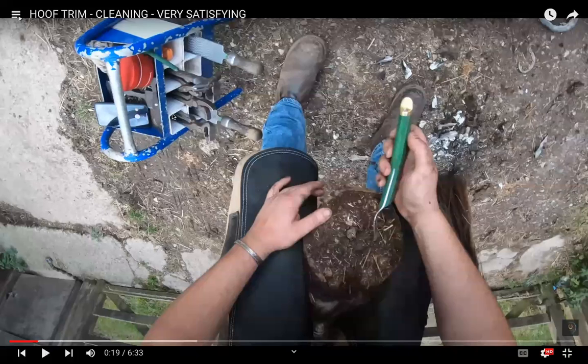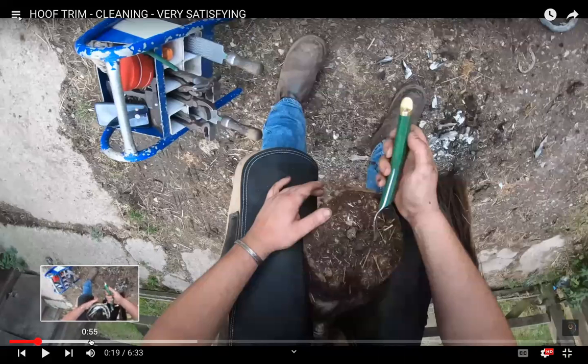So this is the little equipment stand that they have over here. You can see their hoof wraps. This is going to be a hoof pick. So they're going to clean out this dirty hoof. This is normal. There's going to be mud and dirt and sand impacted in the hoof because as they walk, it's just naturally going to happen. So we'll clean the hoof out first, and then they'll start to do their trimming process.